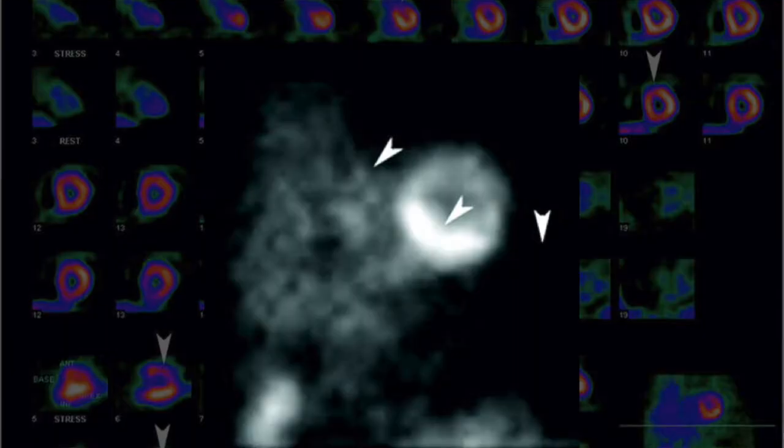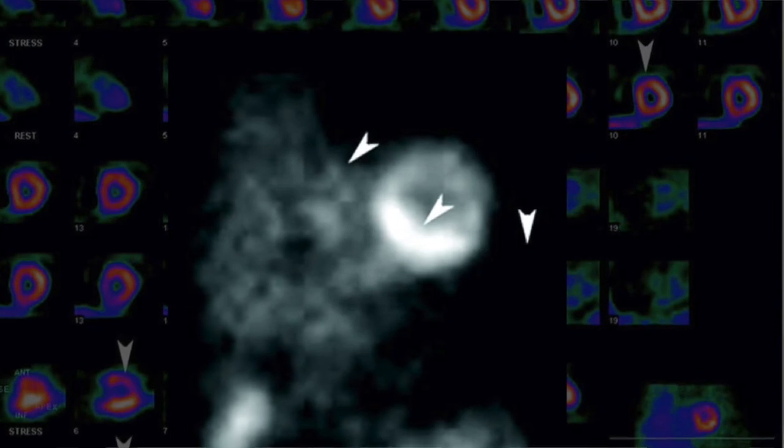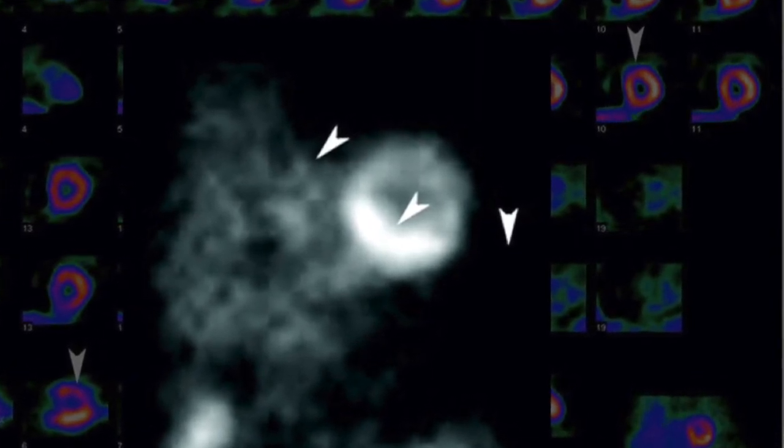But if we go back to the raw data, you can see that the arrowheads are pointing to this crescent-like reduction across the entire anterior wall of the heart, and that's due to breast attenuation artifact. Large-chested lady, it's a fixed perfusion defect anteriorly, not that of an infarction, but simply soft tissue breast attenuation in this case. So again, knowledge of the size and shape of your patient and review of the raw data will help you avoid miscalling this as a fixed defect here, so a potential subendocardial infarction.